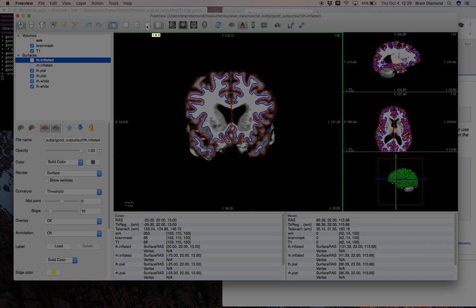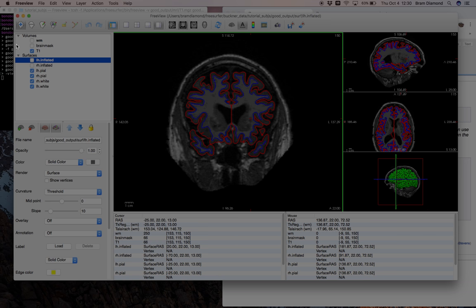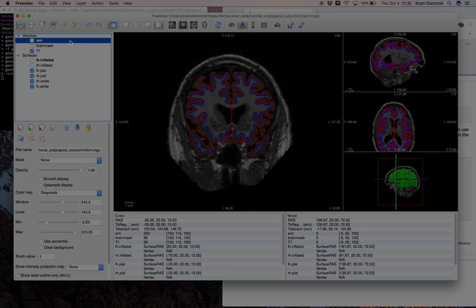On the left you have the loading toolbar and control panel — a list of loaded volumes and surfaces. Volumes are rendered in the order listed: T1, then brain mask on top, then white matter MGZ on top of that. The white matter volume is unchecked, meaning it's hidden and not rendered. The highlighted volume is the active volume, meaning any action will be performed on it, which is not necessarily the volume being rendered.